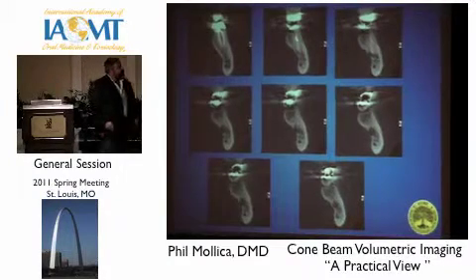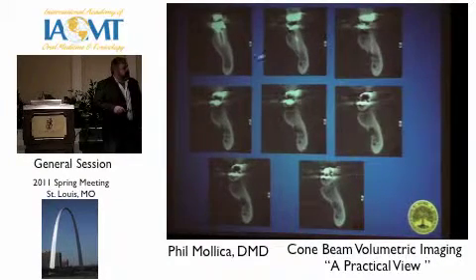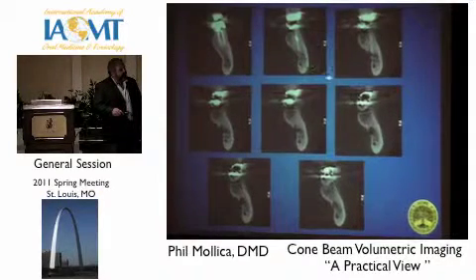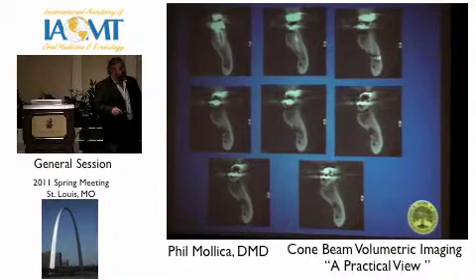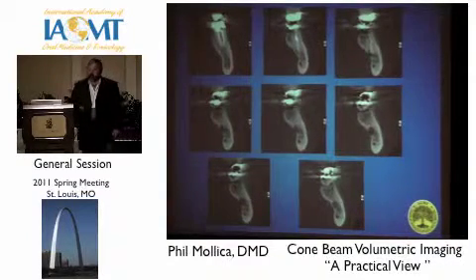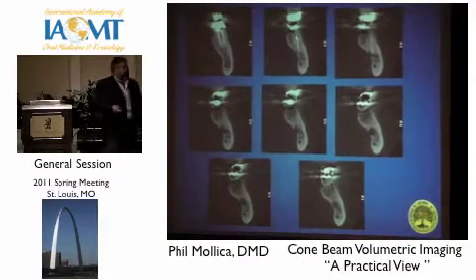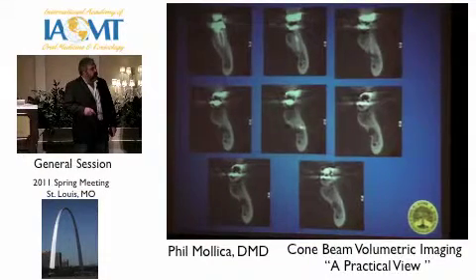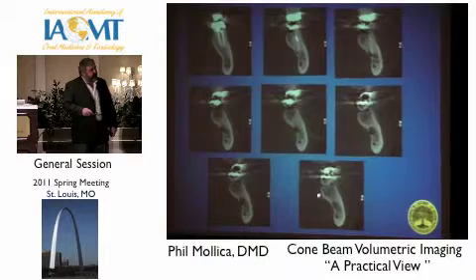Oh yes. With this multiple projecting, we can actually go through with slicing over mesially and distally, and look how the bone starts to dissolve out. I mean, the body tries to naturally buffer these systems. We know it's an infective state. We're getting proteolytic bacteria. It's an anaerobic type of system. We're getting acid here, and look how the body's trying to buffer this. So now we're going in here.